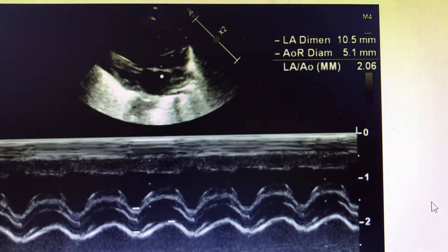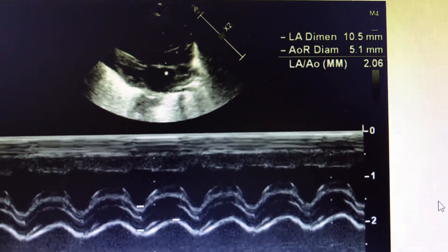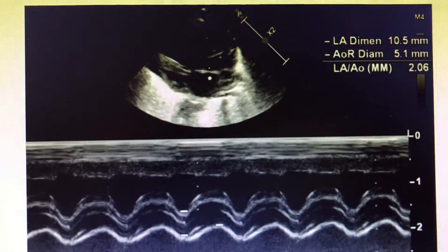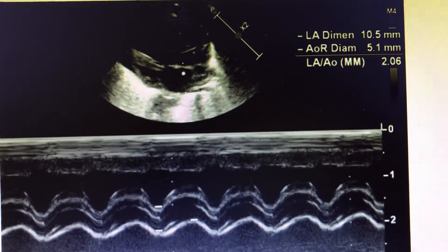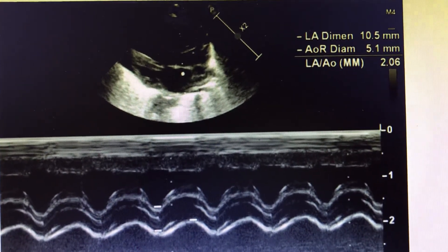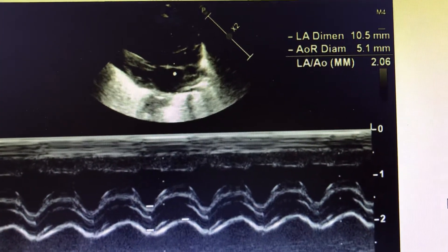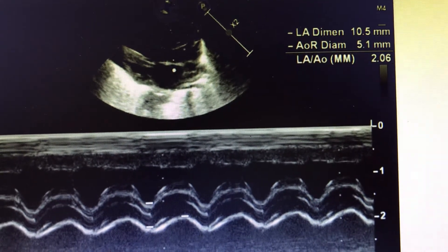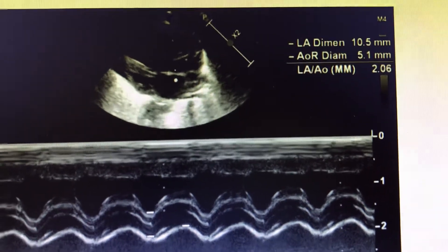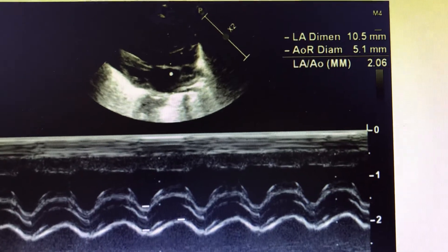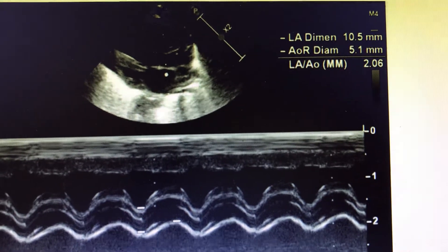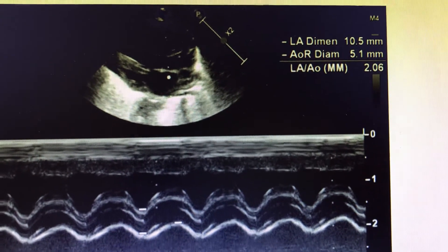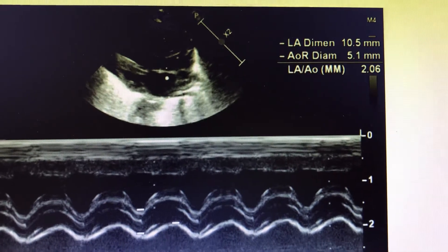To summarize, we have discussed three markers of a large PDA. First, the direct visualization of the PDA diameter — if it is more than 3mm, it is a large PDA. Second, the LA to Aorta ratio — if it is more than 1.5, it most probably indicates a large, non-restrictive PDA. Third, diastolic flow across the descending aorta, which we will discuss further.